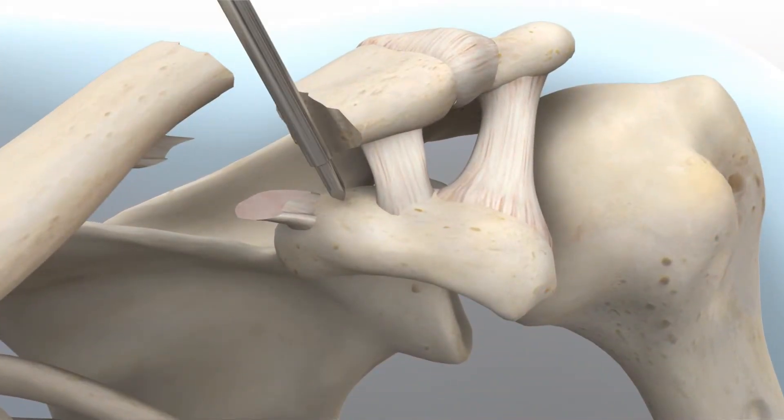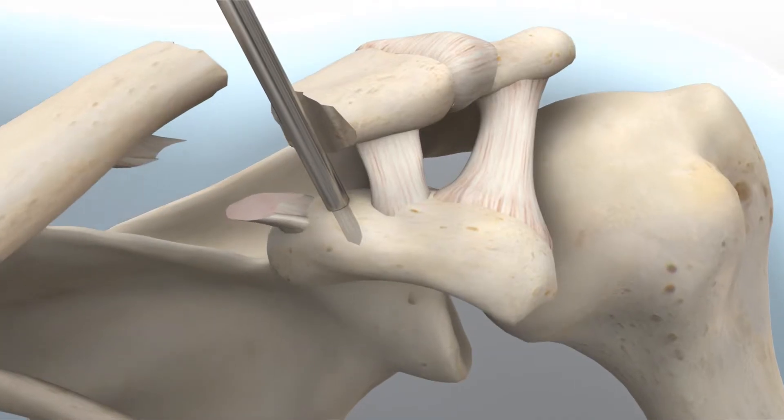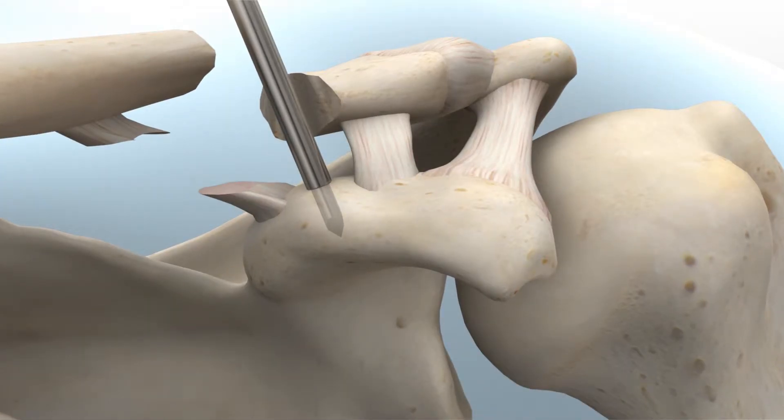Bluntly dissect down to the superior bone surface of the coracoid. Identify the center of the coracoid on the superior cortex to avoid bone cutout, and drill through the first cortex using the AccuSynch drill. The shoulder on the AccuSynch drill should help prevent drilling through the second cortex.